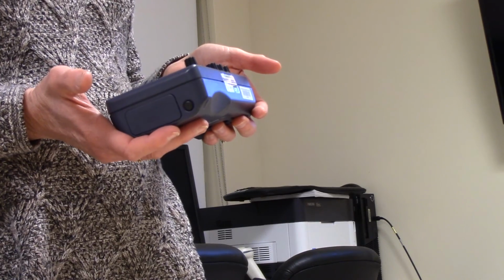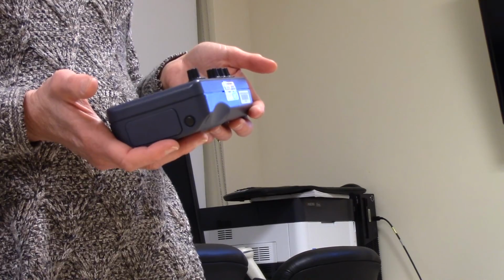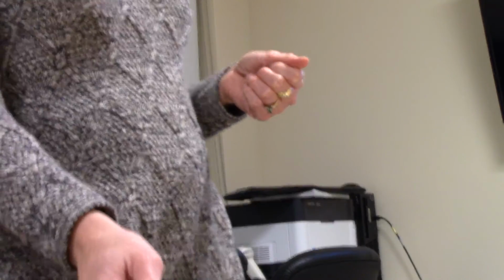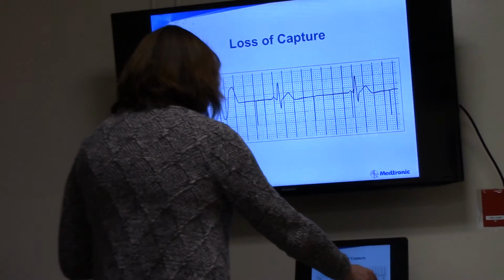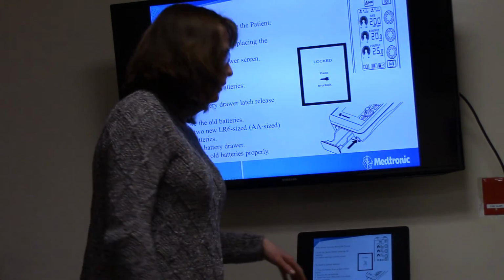Questions? Okay. Is that what we were looking for? Yeah. Okay. I think we went through all the keys and everything. Good.